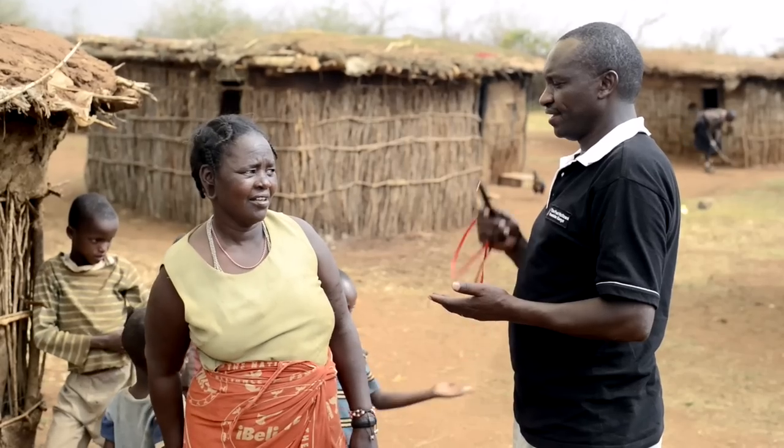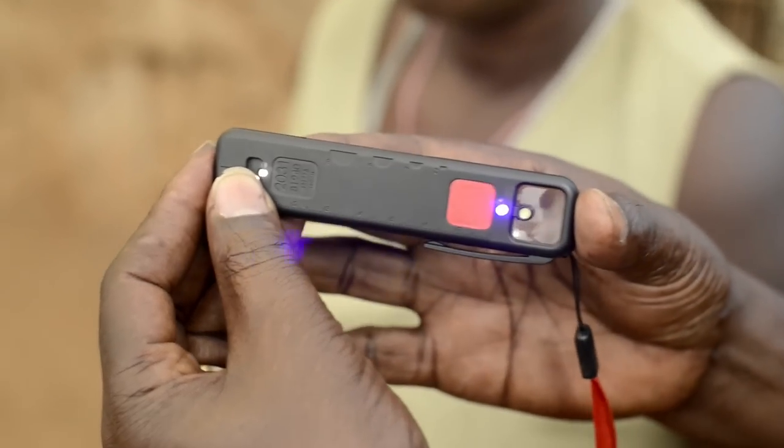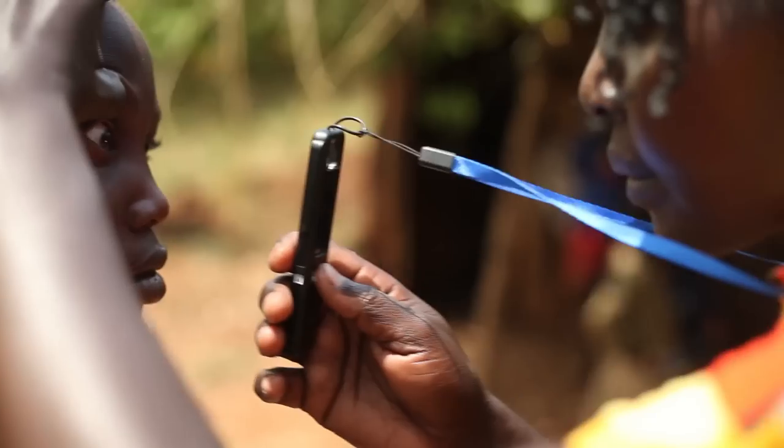When we go to the field, an ophthalmoscope is one of the basic things that we require for every eye worker. One issue is that it is very expensive to access one. So I'm quite delighted to have such a very small piece of equipment, because with only this one, I can diagnose various conditions of the eye.